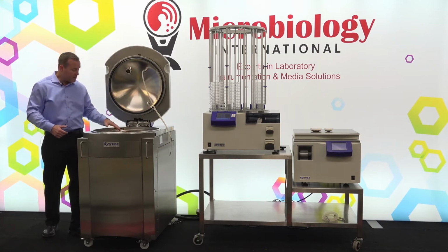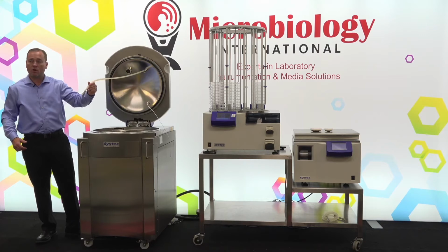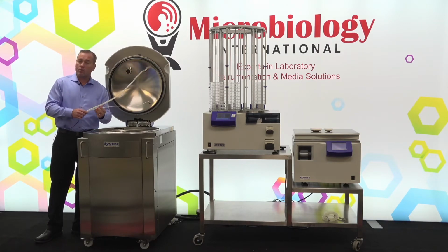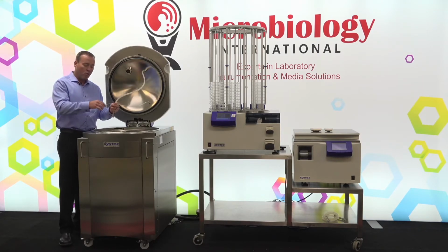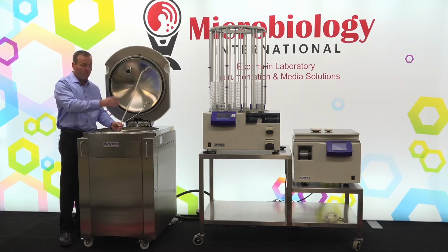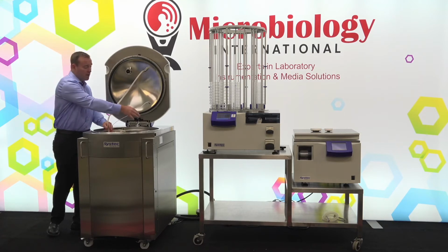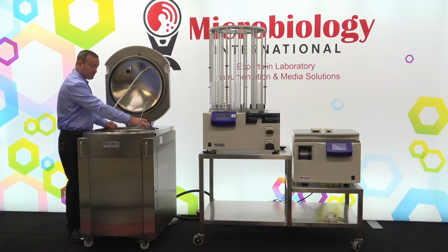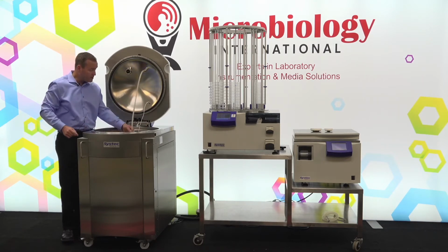Same stirring mechanism at the bottom of it, obviously just a longer dispensing tube that's going to go down to the bottom of the unit, and longer temperature probe. So the one thing that we want to be careful of is making sure that our temperature probe does not get crimped, nor does it get closed into the lid or anything like that upon removal. With the MediaPrep 10, we don't worry about that as much because it's short enough that it's really difficult to get caught anywhere. Once it gets a little bit longer, then we need to be considerate of how we're closing the lid on a regular basis.